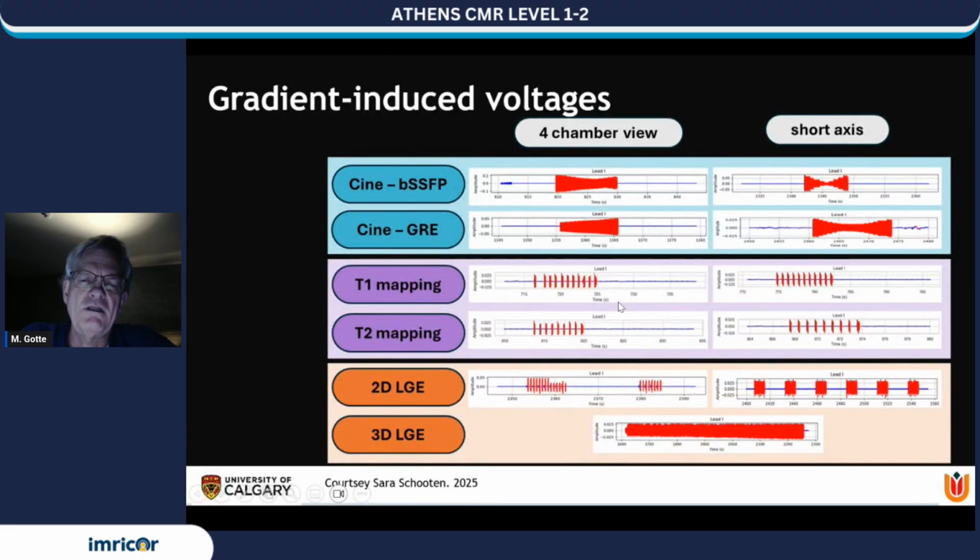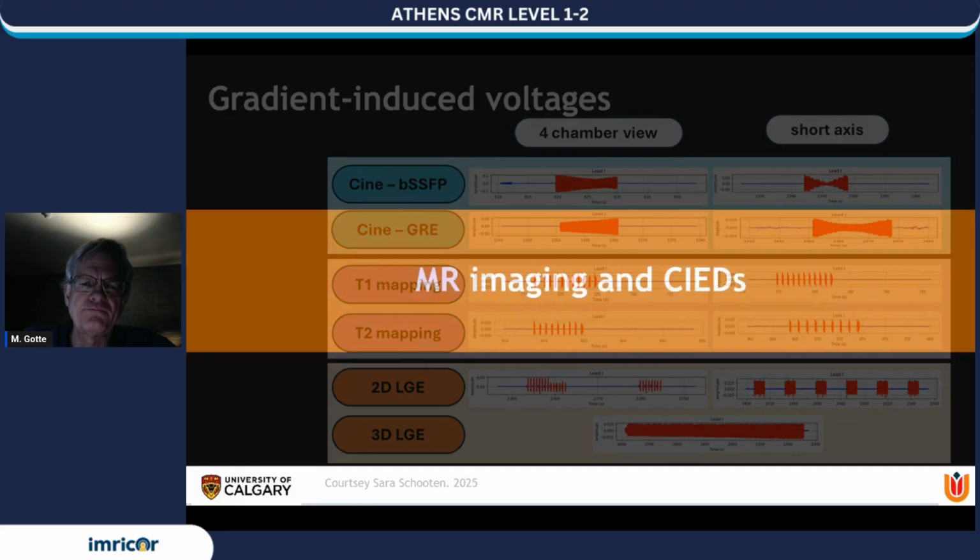So what I mean is acceptable for electrophysiologists to look for tiny details and to interpret the EKG in the way they are used to. And this is one of the strategies. We need to lower the barriers for interventionalists working in the conventional fluoroscopy space. Otherwise, they will never adopt this new technology. This is one of the key components, in my opinion.